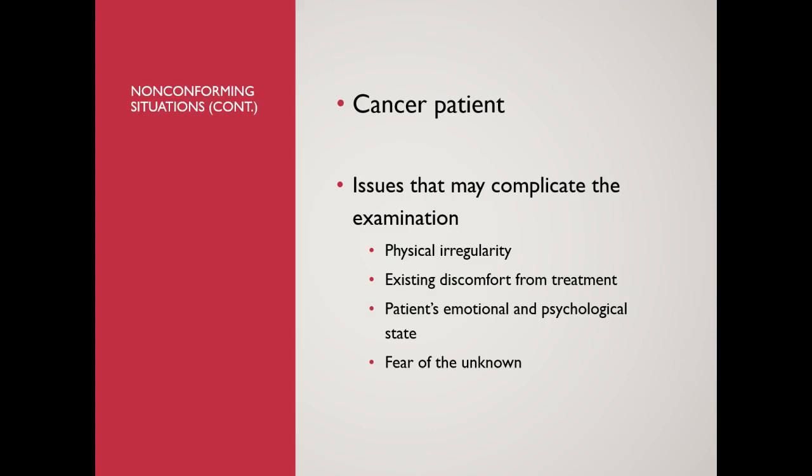Also, there's going to be some discomfort for them because of their ongoing treatment, and the patient may be in an emotional or psychological state that you're going to have to deal with and understand. Of course, there's always the fear of the unknown. However, I have to say that most of the time cancer patients, unfortunately, are very experienced patients. So at this point, they probably are not going to consider mammography territory as the unknown.